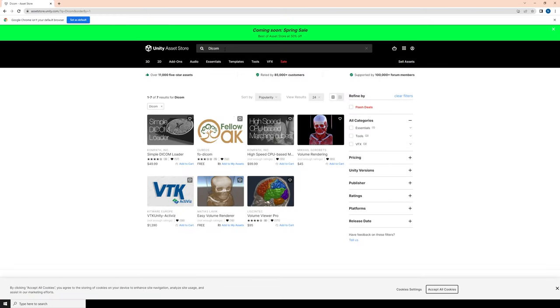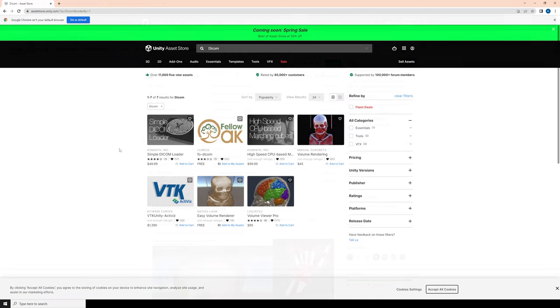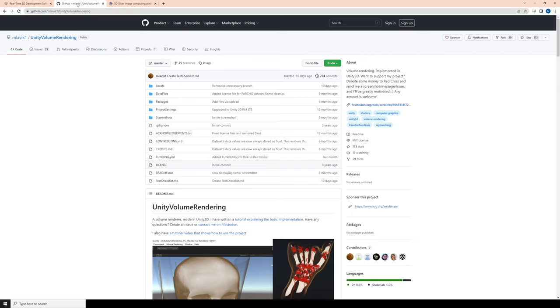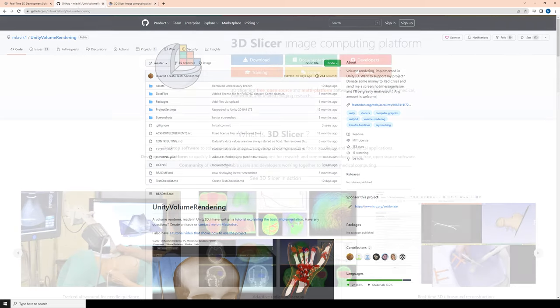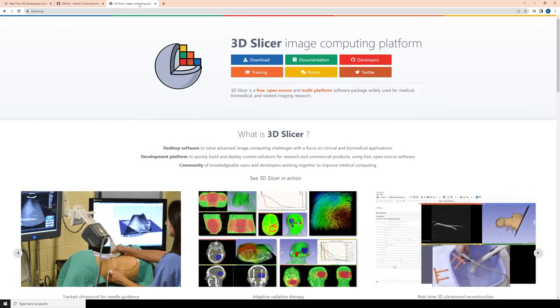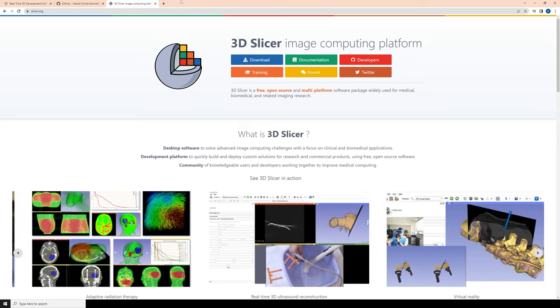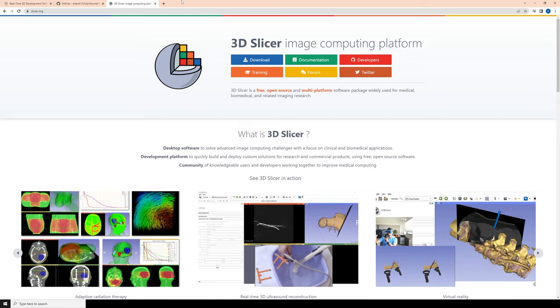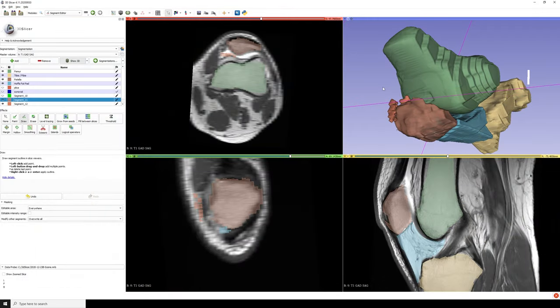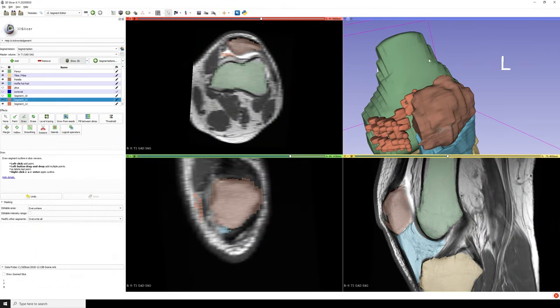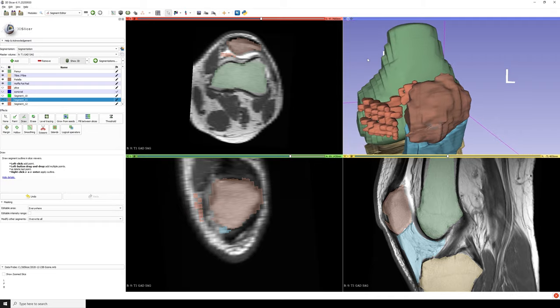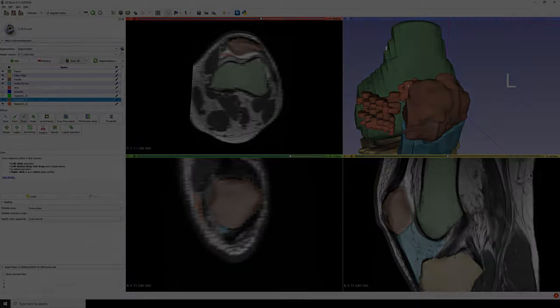There are a few different assets that will analyze DICOM images for Unity. I'm going to use the Unity volume rendering public project here by this developer, and then I'm going to head over to 3D Slicer's website and download this free software. This is going to allow us to trace out segments of the images to make 3D models as well.